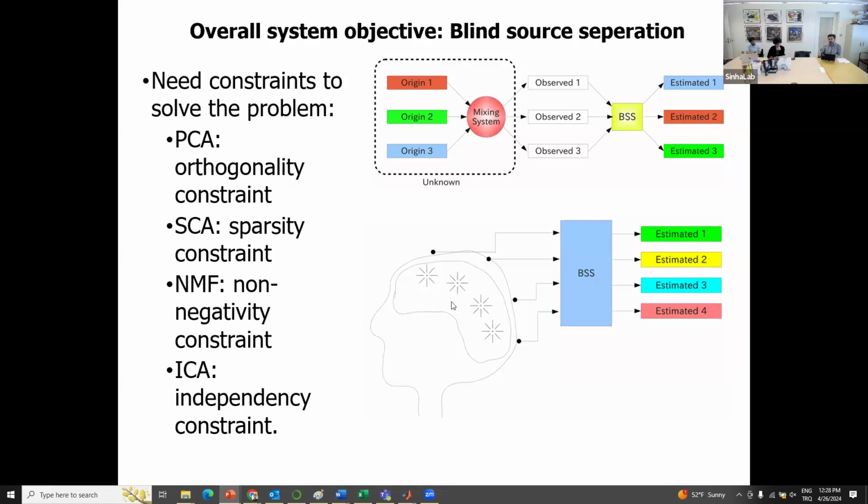But there are two approaches to find the number of sources. One is based on your previous background on the task that can elicit these neural populations to elicit physiological signals, or you can run an fMRI study to identify how many sources are involved in performing such tasks.